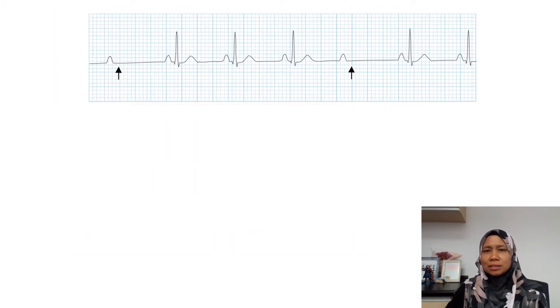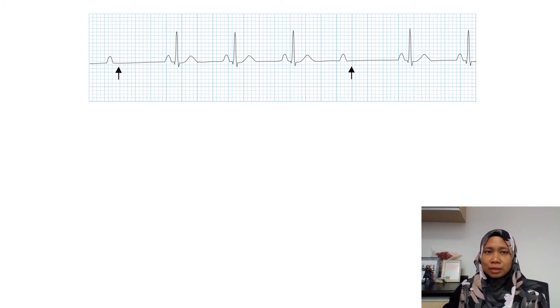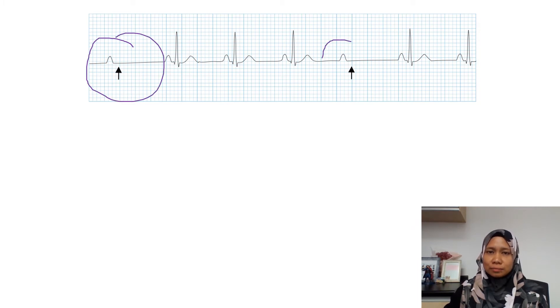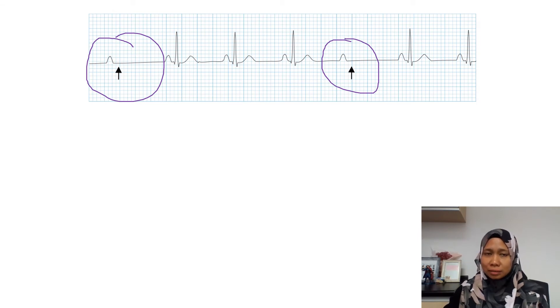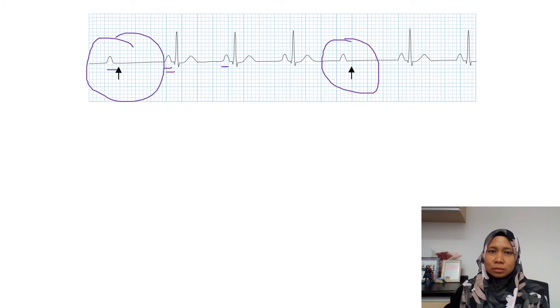So now let's have a look at this one. It is almost similar to the previous one — regular rhythm, but we can see there are a few missed beats. We look at the P wave — the P wave is normal in shape — and then the PR interval. The PR interval is the same throughout the ECG strip.